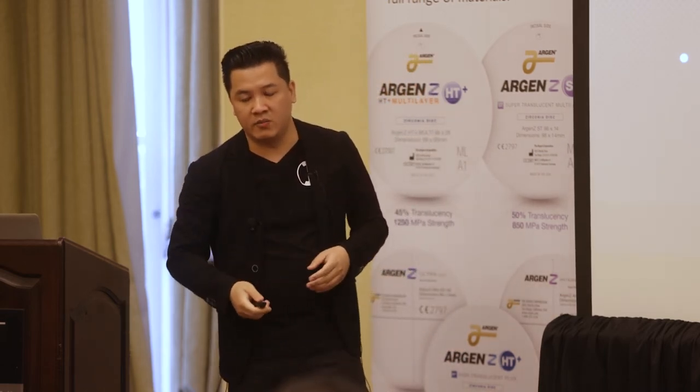For us, we use clear aligners a little bit differently, like in that video you saw in the beginning with all that automation. If you've tried making clear aligners by hand, it is an awful experience. We have some people in our lab that do that, and they have acrylic dust everywhere, trying to get that scalloping. You're not going to compete with an Invisalign.